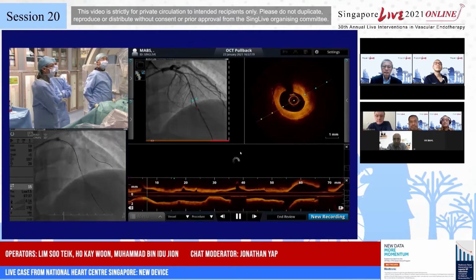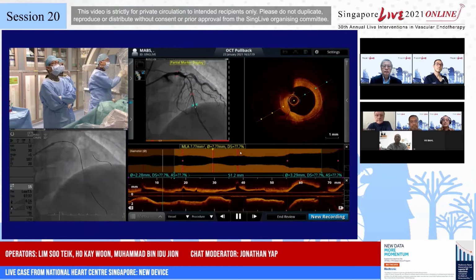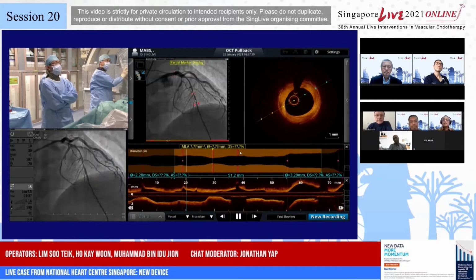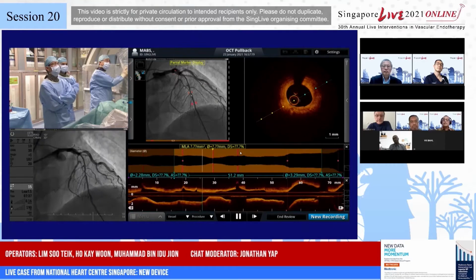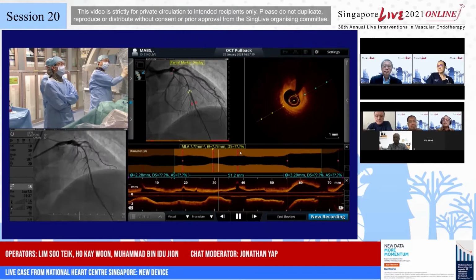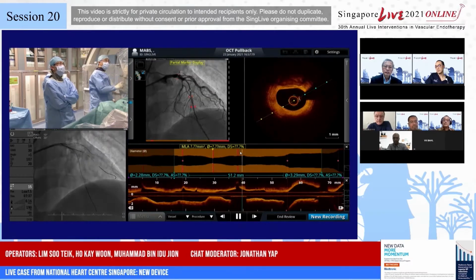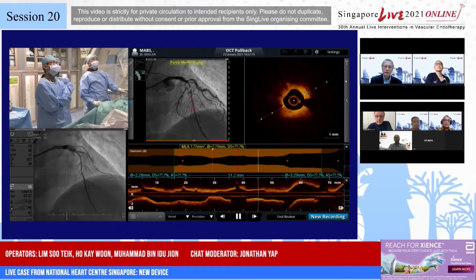You can see from the co-registration, we placed the marker more distally, trying to find a relatively healthy segment to implant the stent. The longest bioadapter that we have is 38 millimeters, but the disease looks longer than that, and we may have to overlap two bioadapters in this case. So it's both an issue of excessive length as well as a proximal to distal size mismatch.